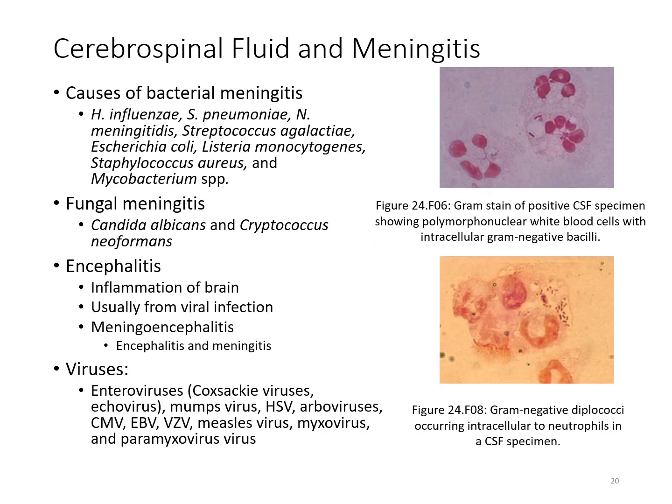Now, with spinal fluids, the organisms that can cause the infection can be various bacteria as well as fungus. A patient can have encephalitis. This is typically going to be due to viral infections, and there are a variety of viruses that can actually infect the brain. Here you do have some gram stains, again, of some intracellular organisms that are present in that spinal fluid.